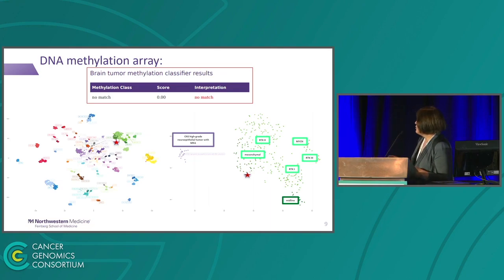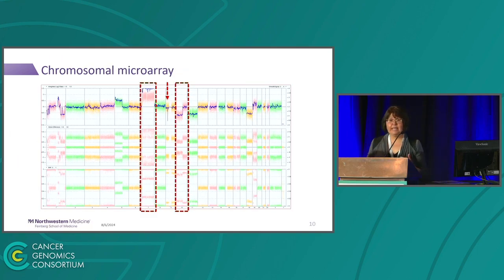And you can see that little star is where the case was classified. It's still in proximity to mesenchymal tumors. It's still intracranial. There is no discussion about it. However, this case was subjected to OncoScan analysis to differentiate between diffuse gliomas and... neuropathology fellows still entertained the idea that it could be meningioma as well.